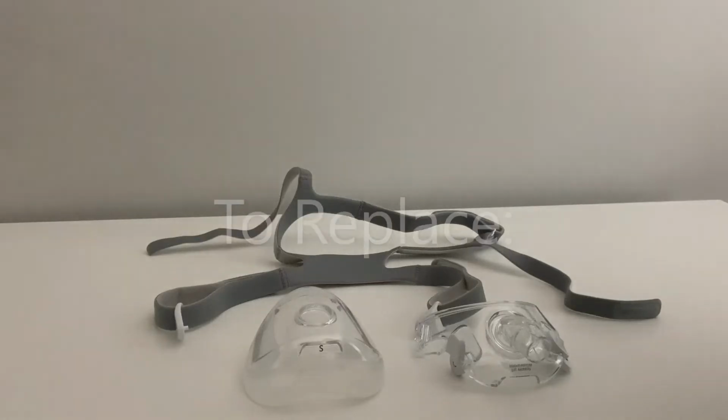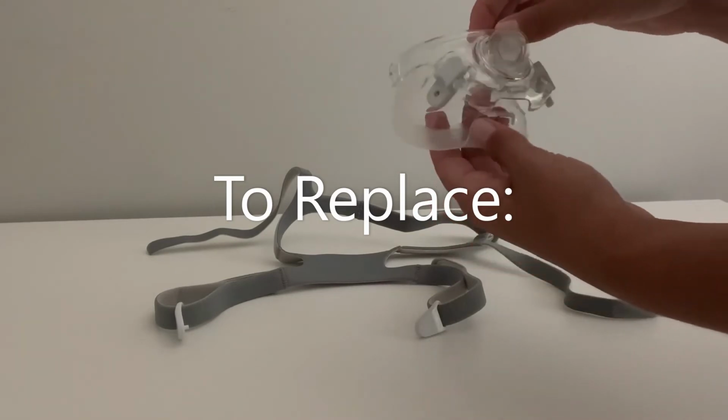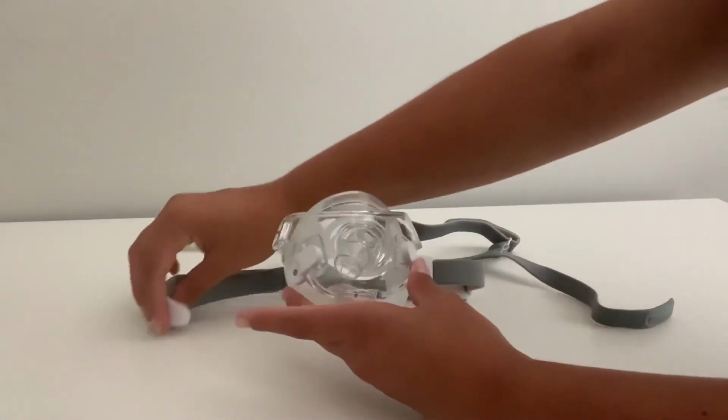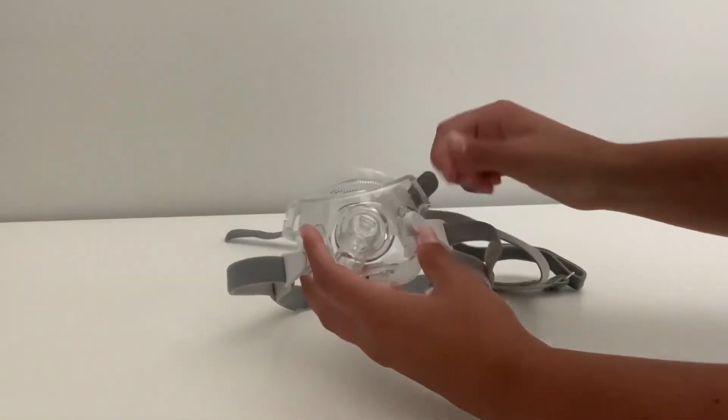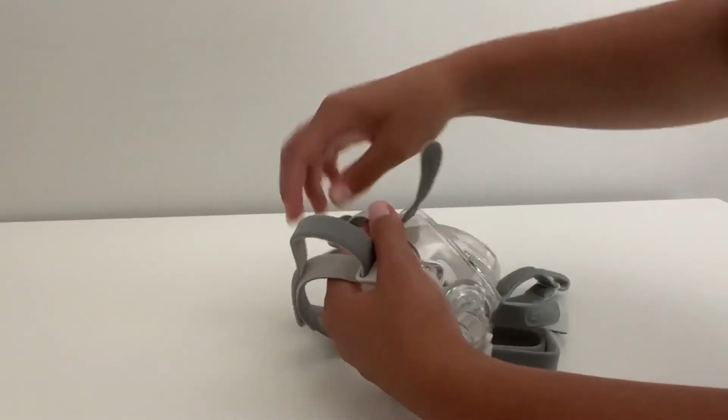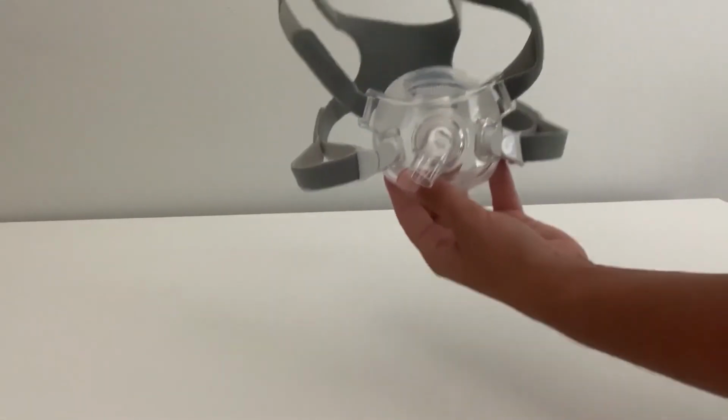To replace, grab your new cushion and gently push it back into the frame. You'll hear a soft click when they connect. Then, reattach the magnetic clips and headgear straps the same way you took them out. Your new cushion is now ready for use.